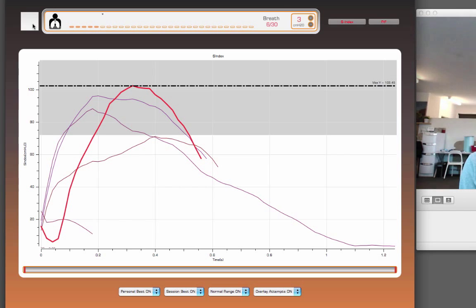Well, that was shocking. It was shocking, but it was still good. So because your diaphragm does lose its force generating capacity as you breathe in, it's really only that first part of the maneuver that we're interested in, okay? I say complete because I also want to have a look at how that curve fades away, but really all I'm looking at is this part here, okay?